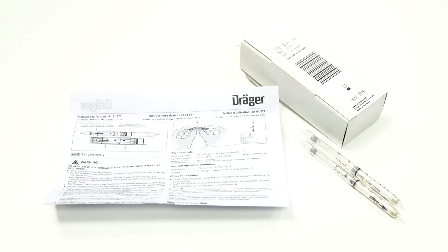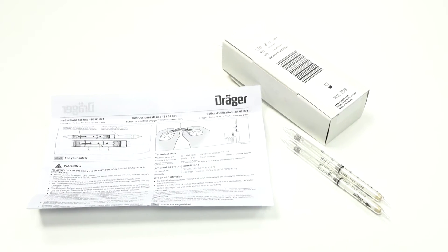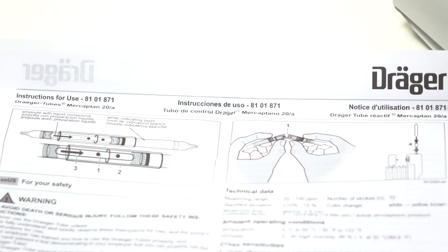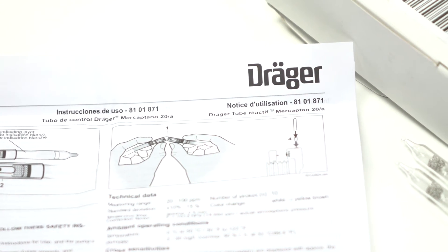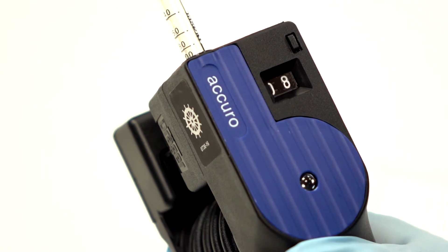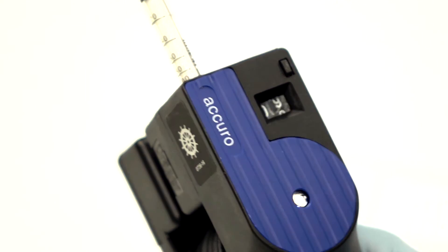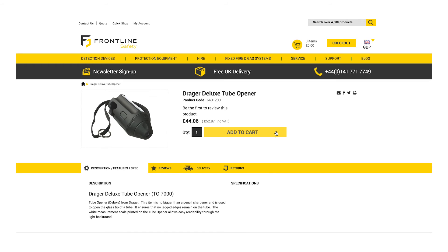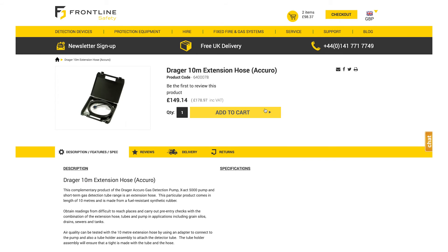You may find that different tubes should be treated differently and may include different steps. Please check the individual instructions in your pack of tubes for additional information on how many strokes, storage instructions, measurement ranges, cross sensitivities, and other technical data. Remember, you can purchase Draeger short-term detection tubes from the Frontline Safety website, as well as a range of accessories for the Acuro pump.